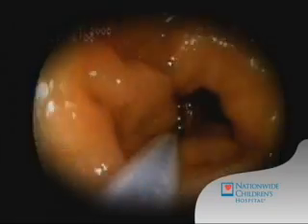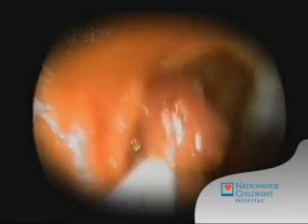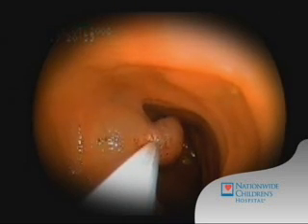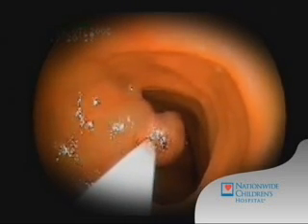Once the polyp is successfully secured, it's gently pulled back and away from the small intestinal wall. Electric current is then passed through the catheter wire. This then generates heat, cauterizing the polyp and preventing bleeding.